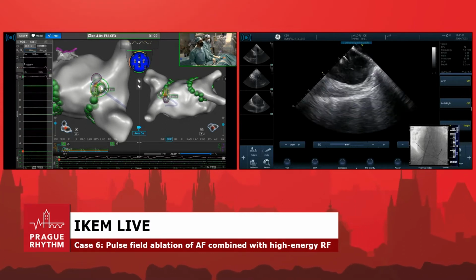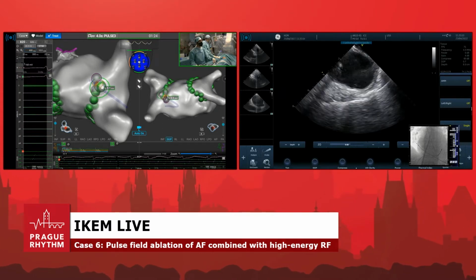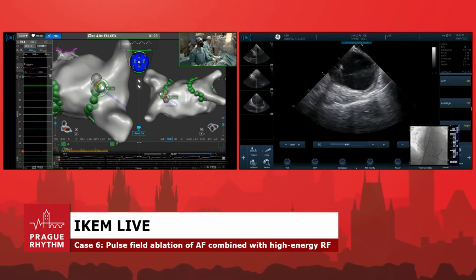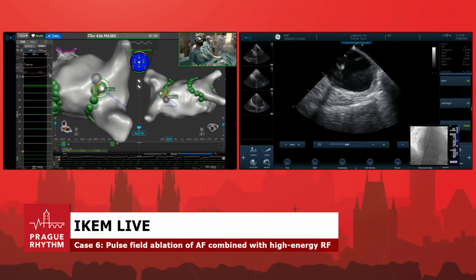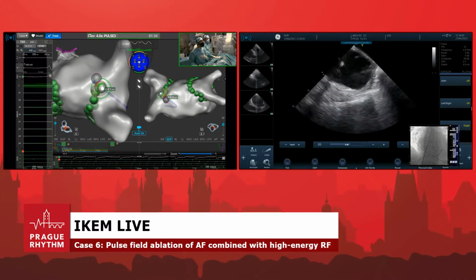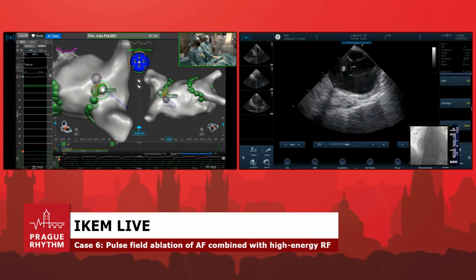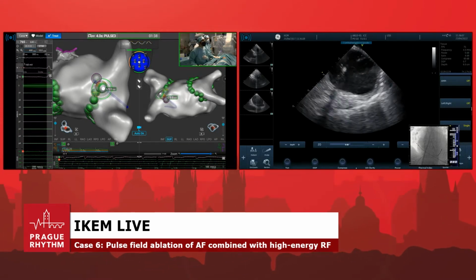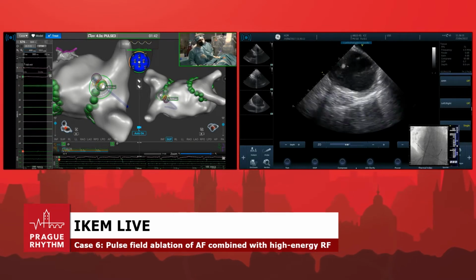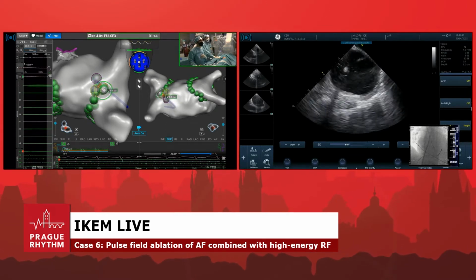Can you update again, please? We can give the atropine, definitely. It has already started doing something. The ECG is normalized now. It's not really clear what happened to us here. So you have the ECG from that period? Let's see the initiation, please. Can you go to the initiation?